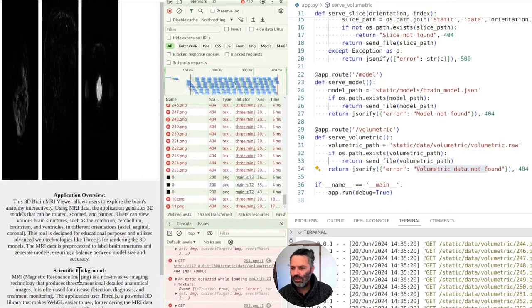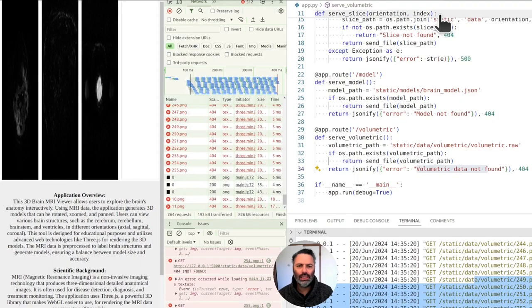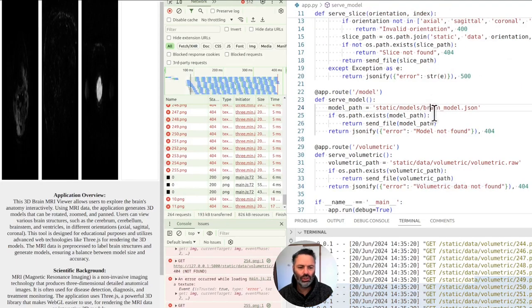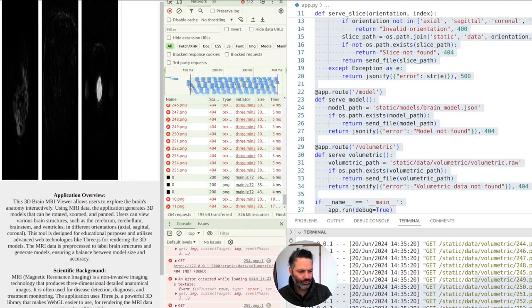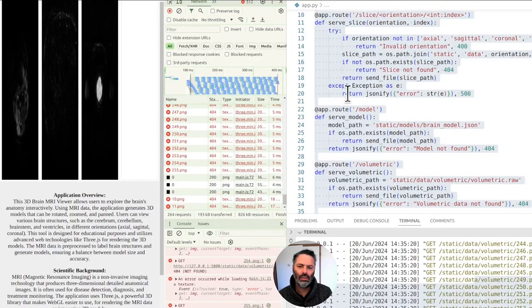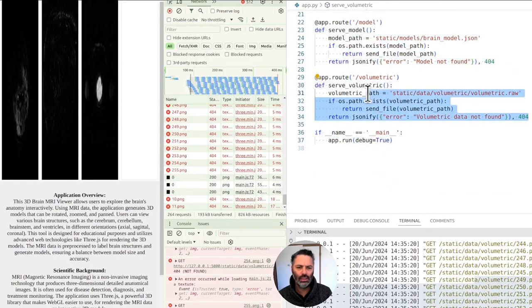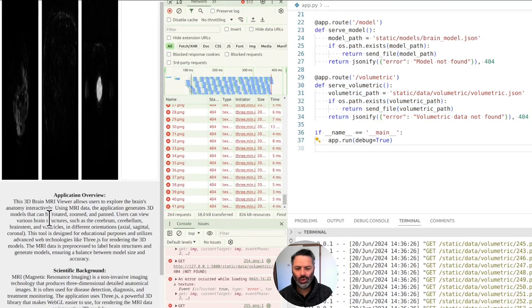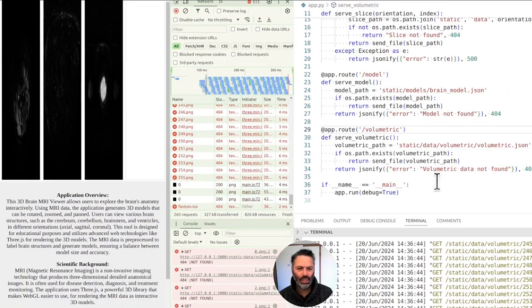We actually need to run the Flask application and for the volumetric data to work we need to change the Flask backend to fetch the correct file, which is the JSON file. Can we change this code — modify it from volumetric data dot raw to dot json? We're getting dot json now.